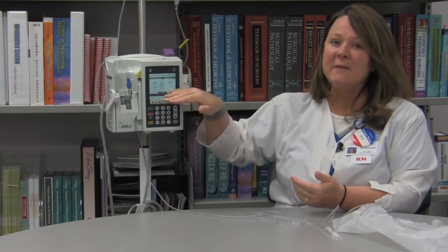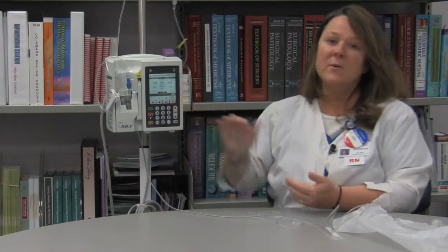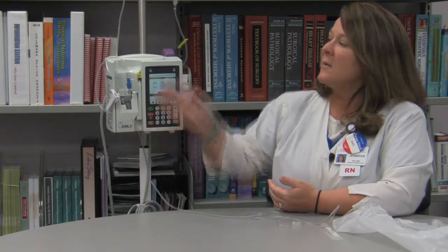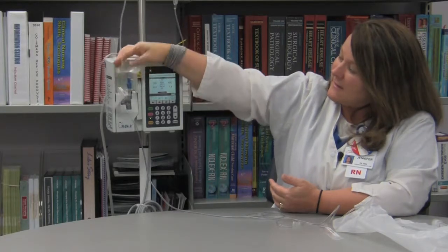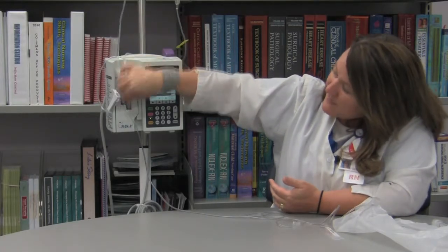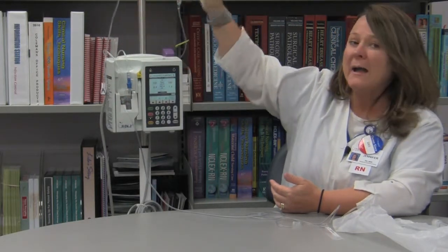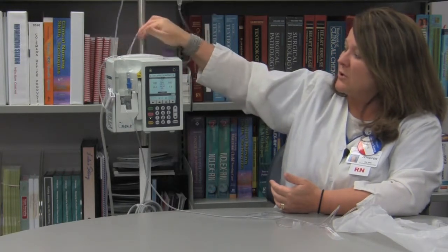Now, if your IV pump alarms, there's a couple of things that could be wrong. Number one, if it alarms and says KVO, then your fluid is almost empty and you need a new bag, or you need to reprogram your volume to be infused. If you walk in the room and it's beeping proximal occlusion, that means the tubing above the cassette is kinked off. That sometimes happens. These tubings will bend down. So you always want to be sure you have your IV pole high above the pump, and this green thing kind of out of your way kind of helps guard your tubing.